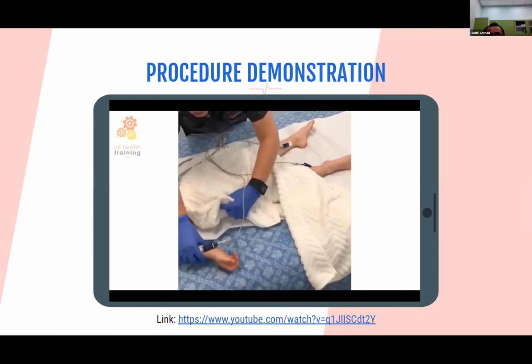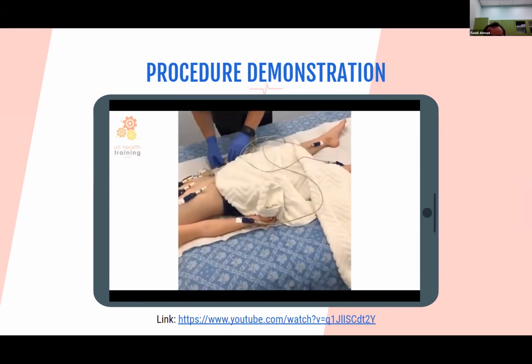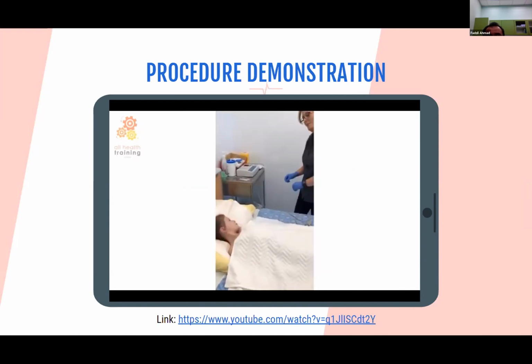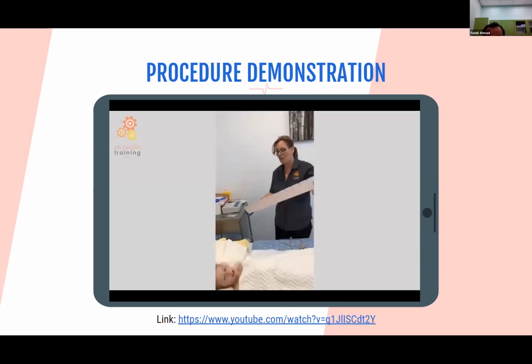So Ella Rose, in a minute, I'm going to get you to lay. So now we have all the electrodes on. We're going to instruct the patient to lay nice and still, no talking or moving for a moment. And we just cover her up to maintain her dignity. When she's laying nice and still, we have a nice clear trace, nice steady heartbeat, we're going to start.